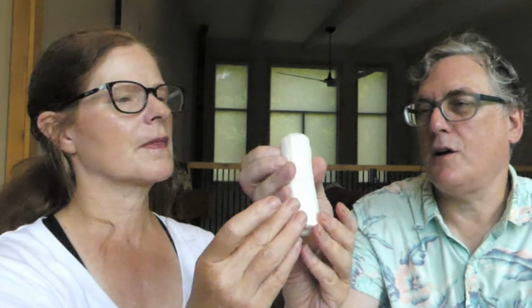It has a core in it with a hole in it, so this is solid and stable. With most modern ones, they fall apart very quickly. This is solid. A plus. Definitely, I would use this. Very good. And again, I'm going to reuse this. I'm not going to throw it away. And if we have mass casualties, I will happily use this. For sure. Especially because, like you say, that wouldn't necessarily be right against the wound.